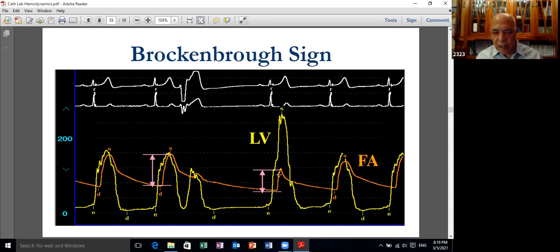Actually, you can get other changes in addition to the decrease in the pulse volume, and that's the spike and wave appearance, or the spike and dome, or the bisferiens curve, which are synonyms for the specific pulse wave of hypertrophic cardiomyopathy. So if you look again into this wave, you'll see it's not the wave of valvular aortic stenosis.